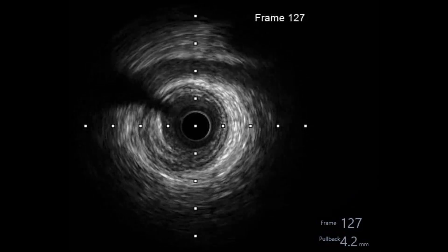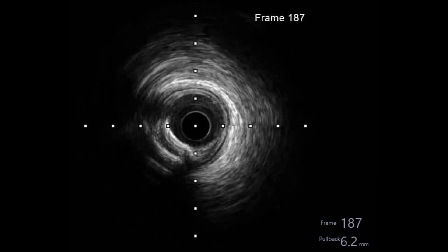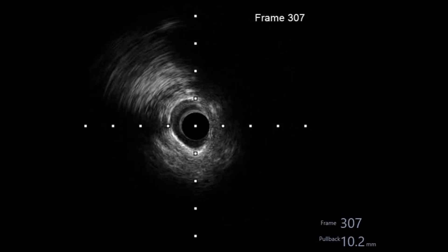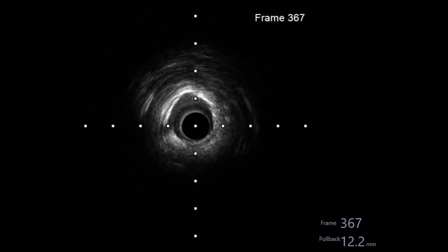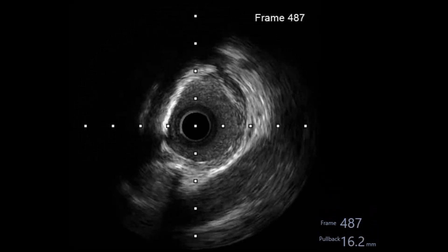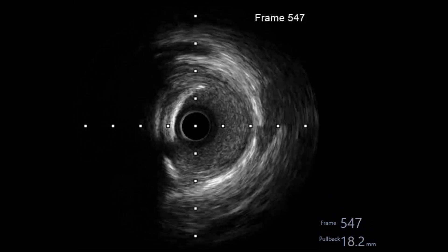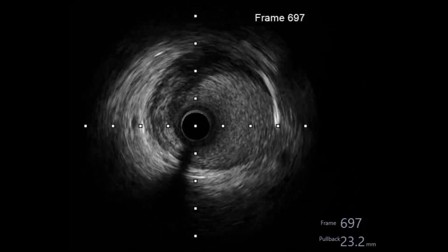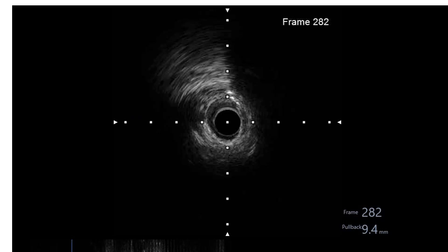The IVUS shows the distal vessel diameter around 3 mm, and then this is the most tight part, with a ring of calcium. The proximal part has a large diameter. This is the tightest part of the vessel, measuring around 1.9 mm square in area.